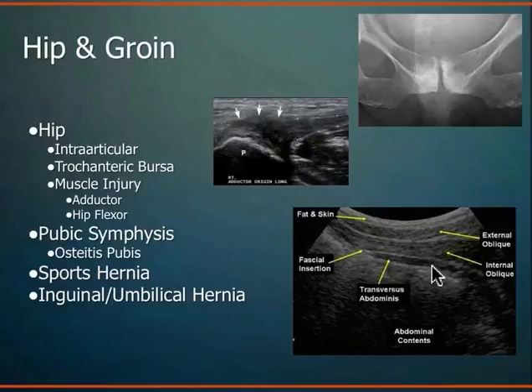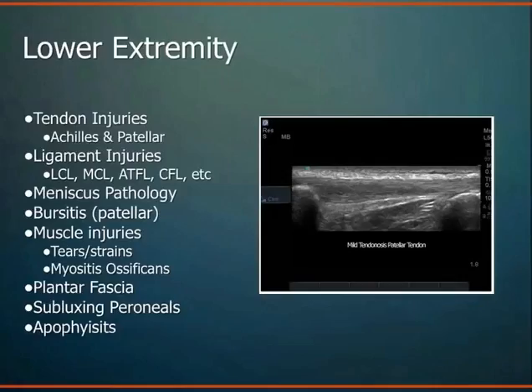with ultrasound. Another very common source of pain in the groin in athletes particularly is osteitis pubis, or just kind of chronic changes at the pubic symphysis, inflammation. And the best way to work through your differential on that is to inject it. It's obviously a sensitive area to inject, so you want to have image guidance. You can see it quite well on ultrasound and use ultrasound guidance for those injections.